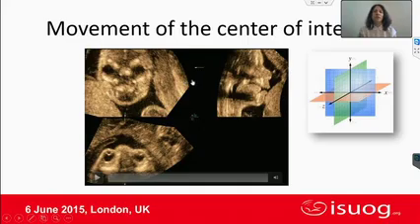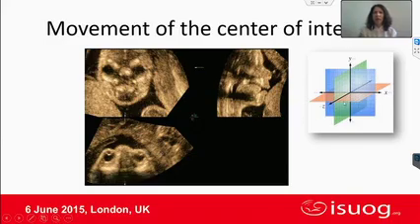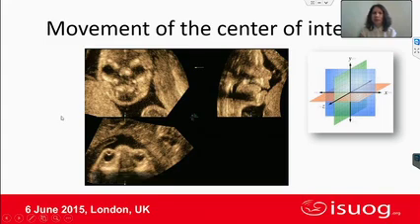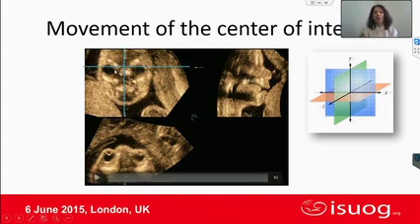Here you can see the fetal face. This is the coronal plane of the fetal face, the sagittal, and the axial plane. As you can see here, the coordinate system. The dot here is in between the fetal eyes, and it is the same place in all three planes. So I just mark it.